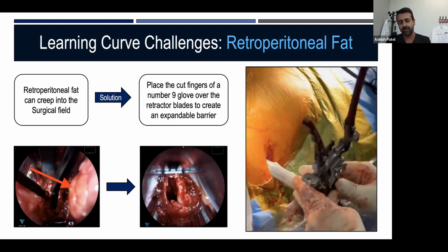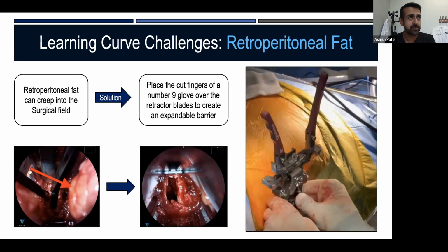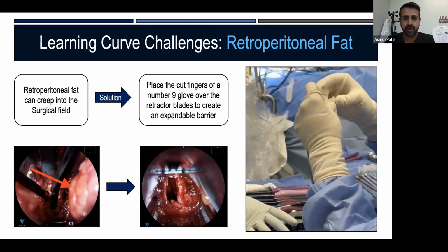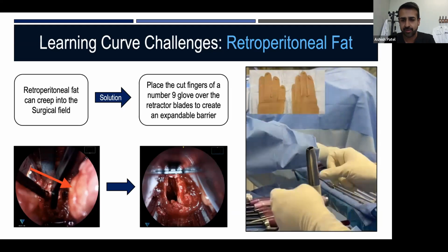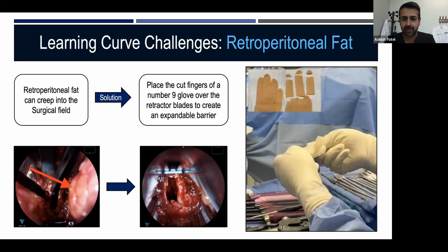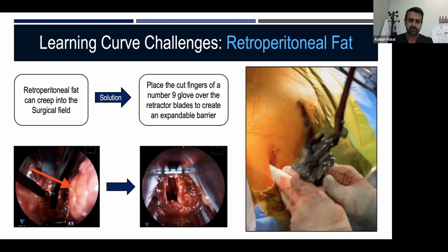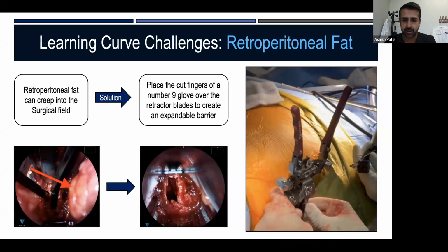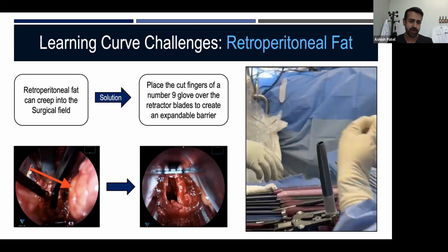So, it's really based upon what you have available at your hospital. Experiment with it. It's going to be between an 8, 8.5, and a 9. I haven't seen anything more than that, but it'd be perfect if there was some specific product that was designed just to do exactly this, and it's just one single unit that we could apply, and it'd be the same everywhere. Wouldn't you think?